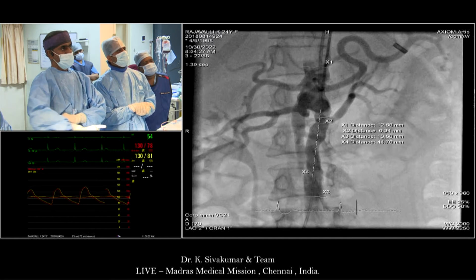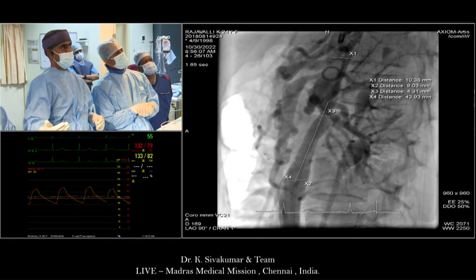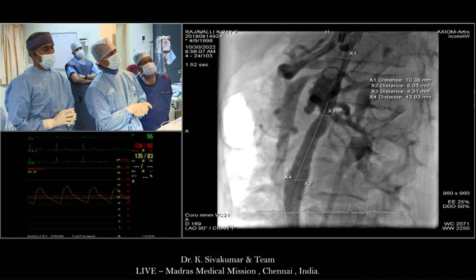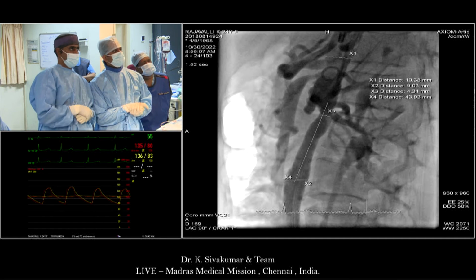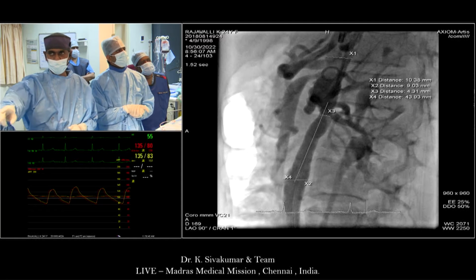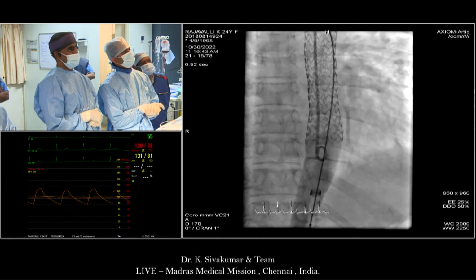Show the next lateral view. In that lateral view, freeze it. What is protruding down is the proximal renal artery, a sort of aneurysm that is like a pouch. And then the narrowest portion is here. Now go to the 24th angiogram. This is where we left you.